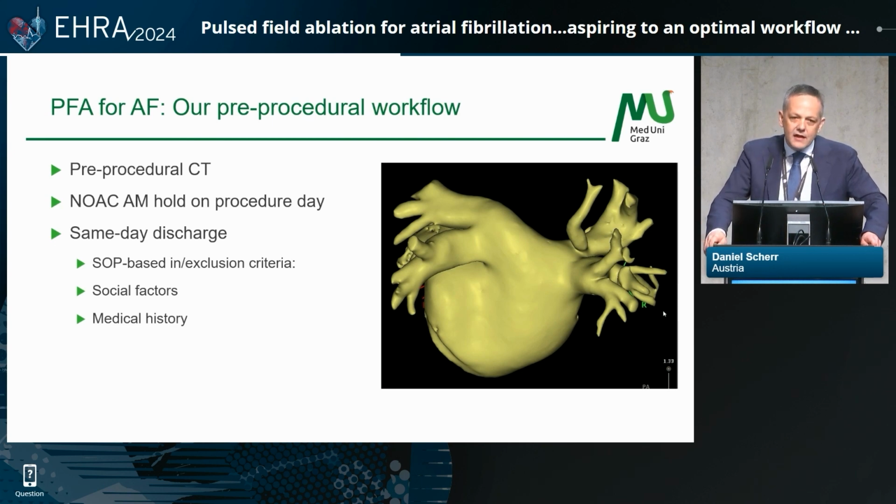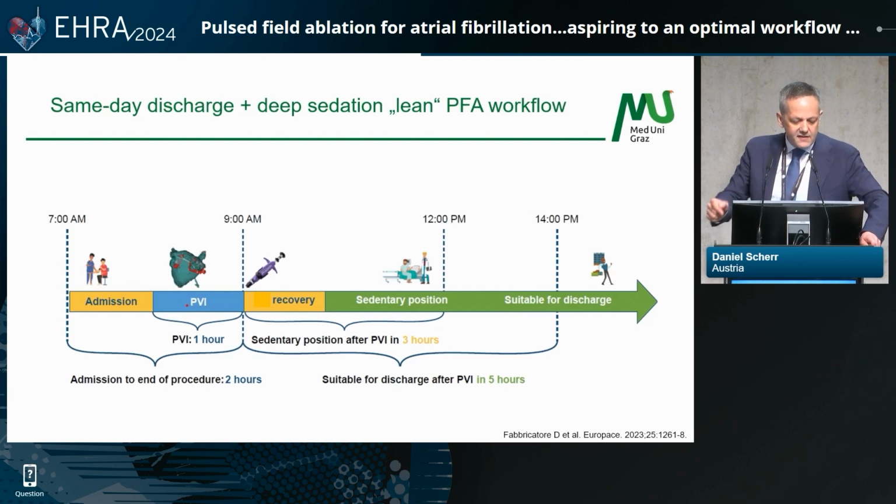And just for the medical history, to name you a few of the factors, we don't want heavily obese patients, and we don't want patients with severe chronic obstructive pulmonary disease for same-day discharge. Now, this same-day discharge concept goes along with the deep sedation protocol, the propofol protocol, to create a lean PFA workflow and to allow us to discharge the patients on the same day and to treat more patients with the same number of beds and the same lab capacity.